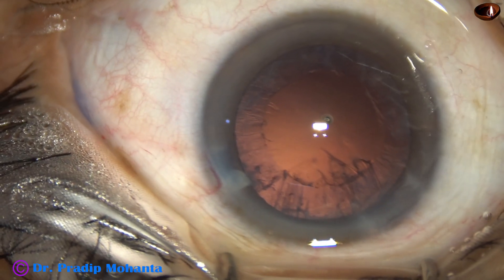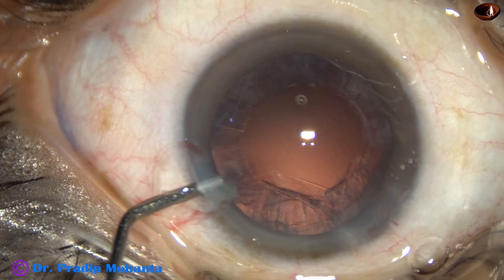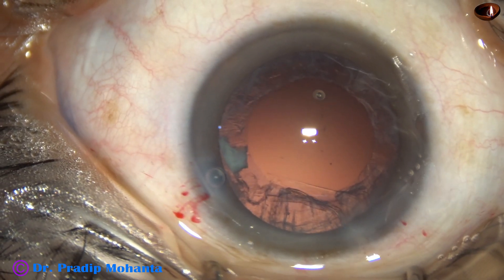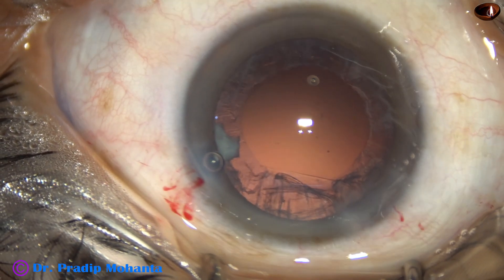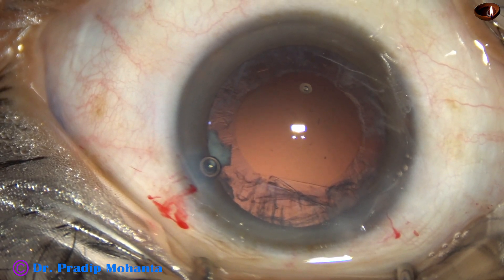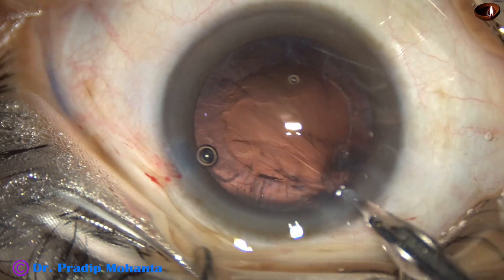There is a nuclear piece at the side port; we must remove that first. The piece is just prolapsed from the side port, and now a 23-gauge Simcoe is used to guide and escort this nuclear piece to come out of the anterior chamber.